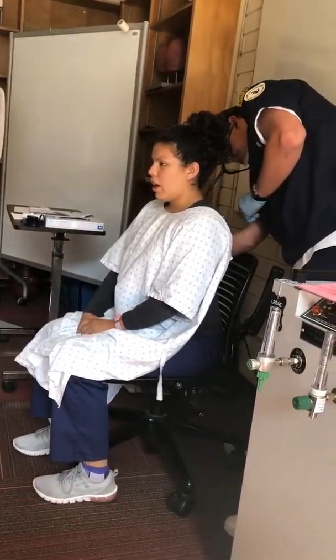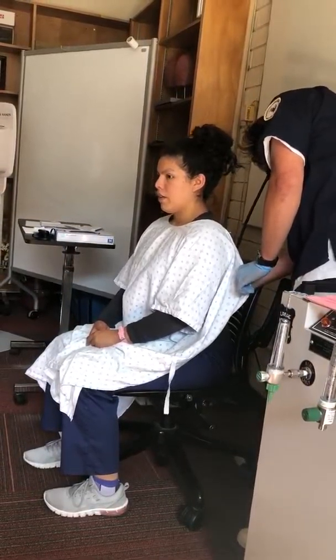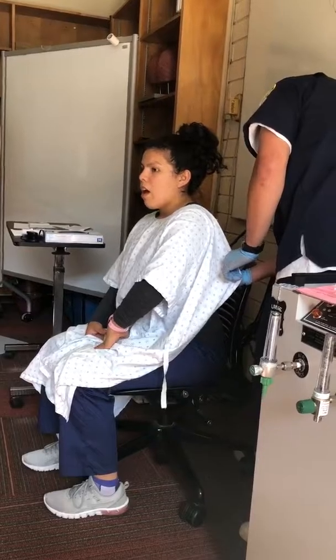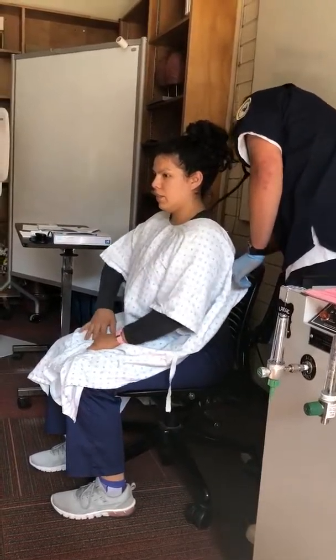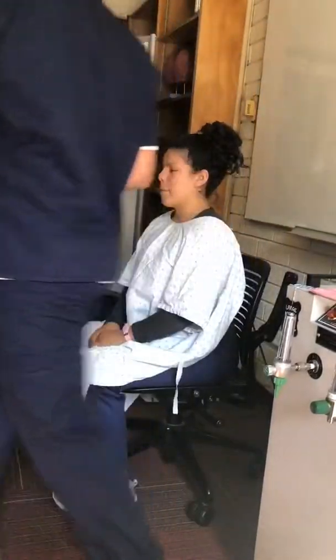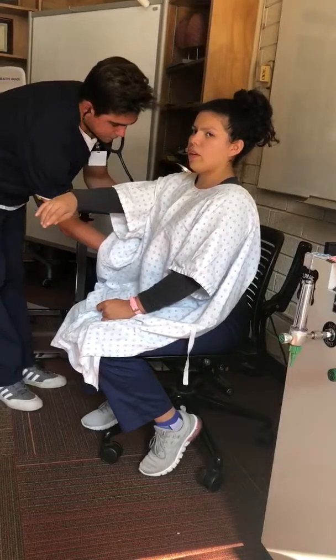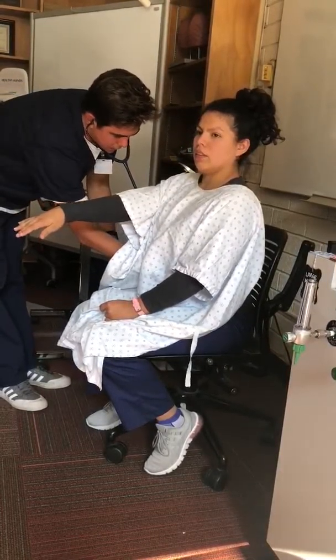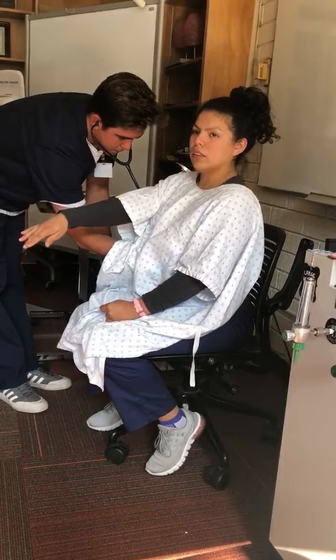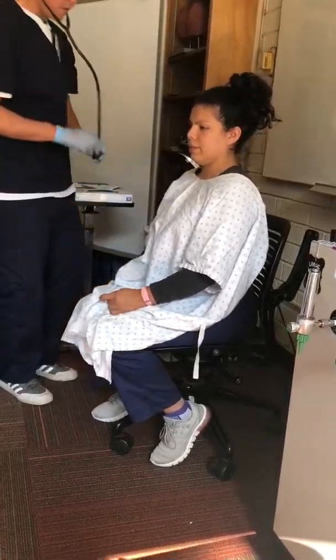Good job. So we're going to do the 2 on the side right now. Mid-axillary line. Good job. Okay, it's going to be mid-axillary line under your armpit. Thank you. Good job. Okay, we're going to do the same on the front again. Okay, thank you very much.